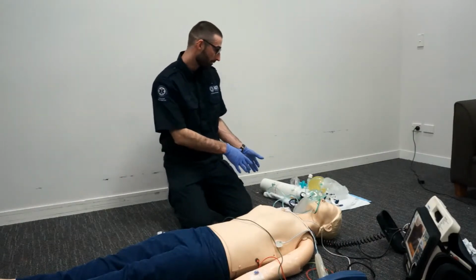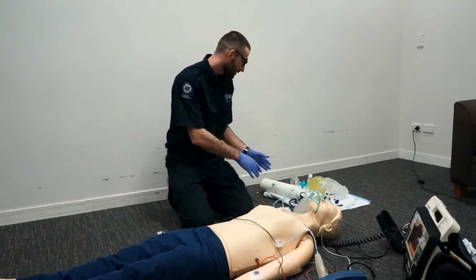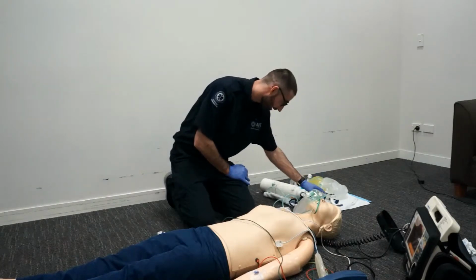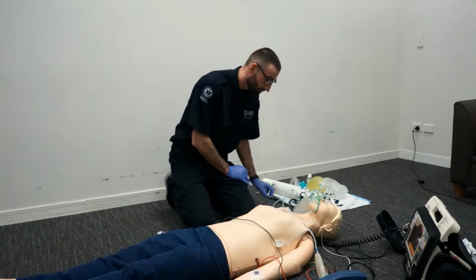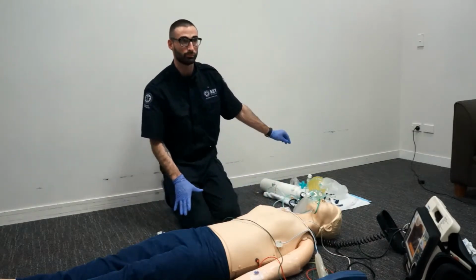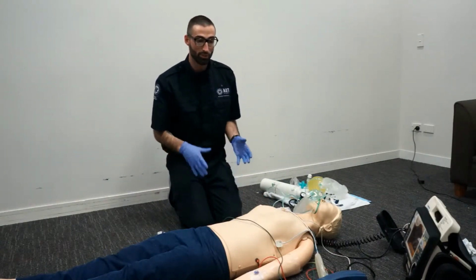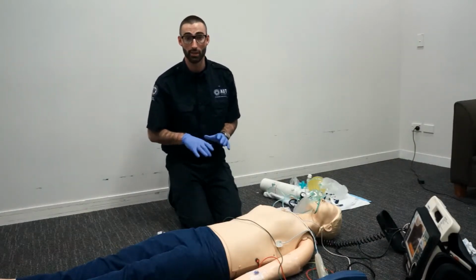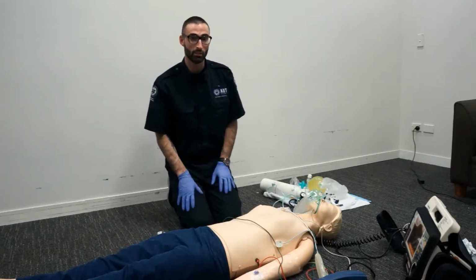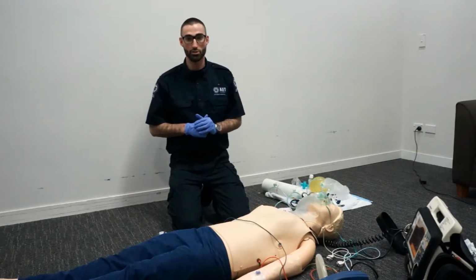And on the side here, we have our resus equipment, so our bag valve mask, our LMA, NPA, and OPA airway adjuncts, and high flow oxygen. We want this equipment just in case our VT deteriorates into VF and causes cardiac arrest. Done. We can go ahead with our cardioversion checklist.